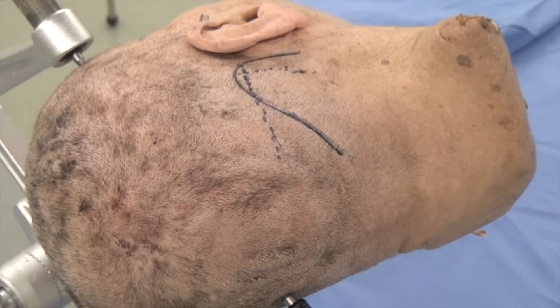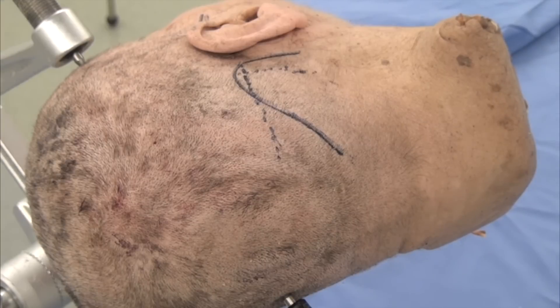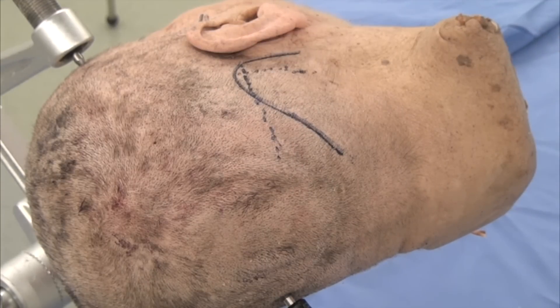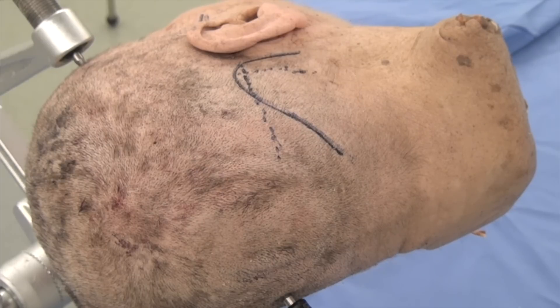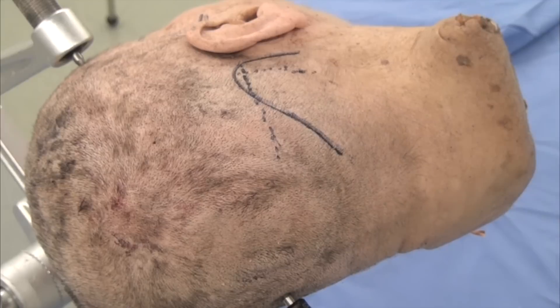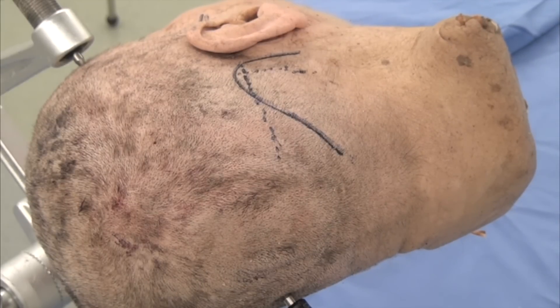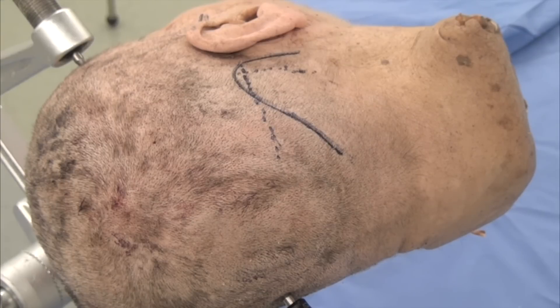Incisions for sub-occipital craniotomy can be very varied. Many surgeons use a curvilinear or linear incision. We have come to really like the curvilinear incision, and I would like to review some of the basic concepts for this incision and its advantages.